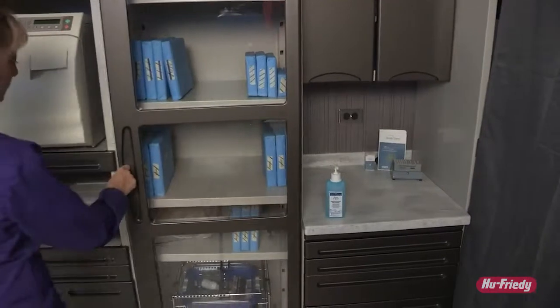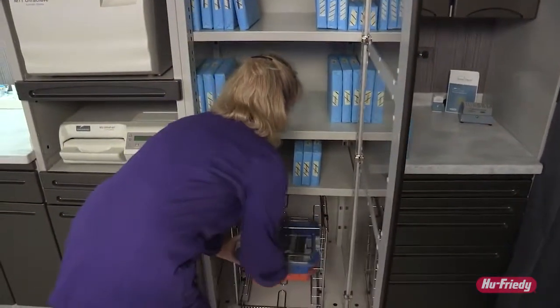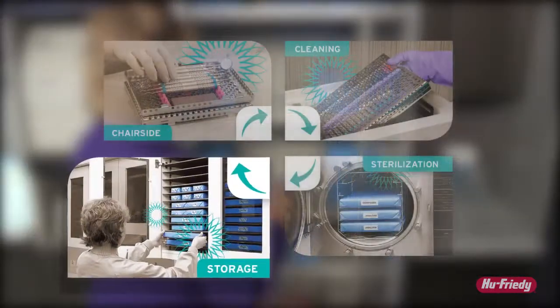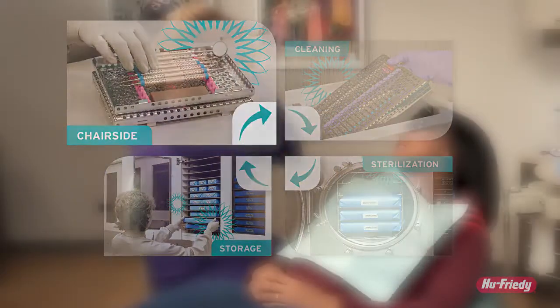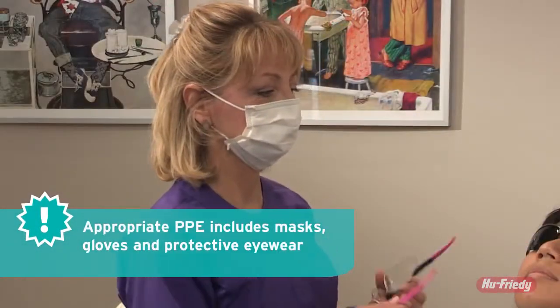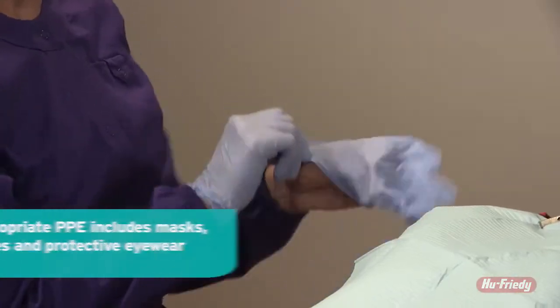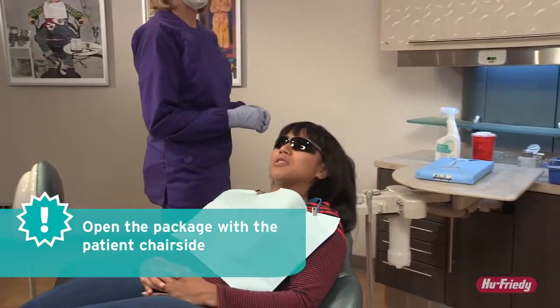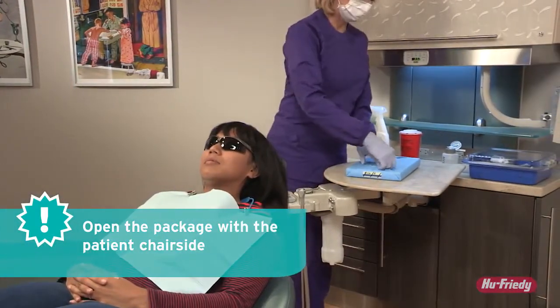Identify the cassette needed for the procedure and select its matching organizational tub if it is not stored in the operatory. Appropriate PPE should now be donned before patient treatment. It is best practice to open the sterile pack after the patient is seated to provide assurance that the instruments have been sterilized.